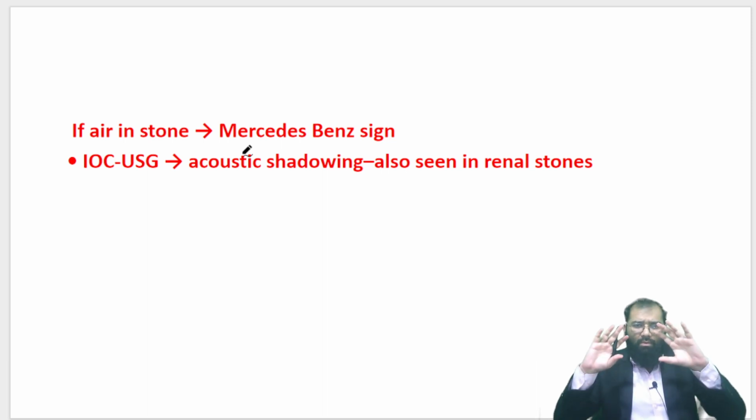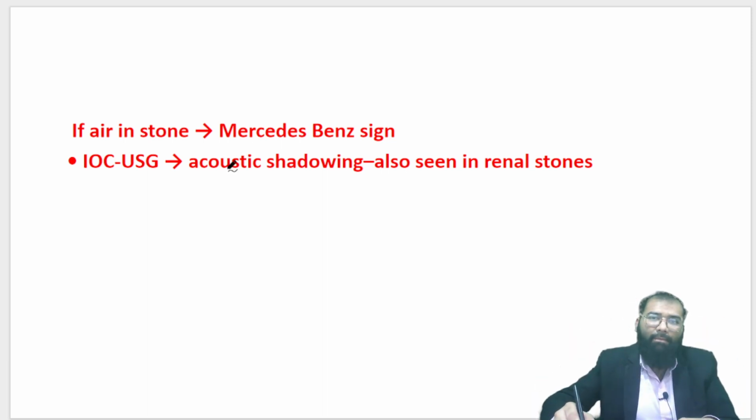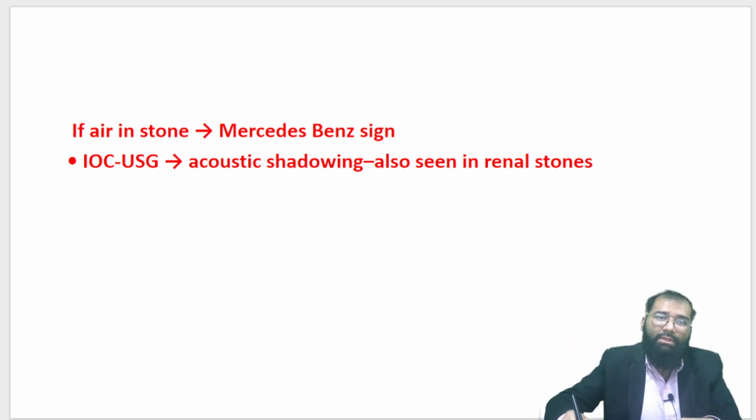Okay. Now, we will move further. A special sign. See, sometimes you might have a calculus, and within this calculus there might be air.